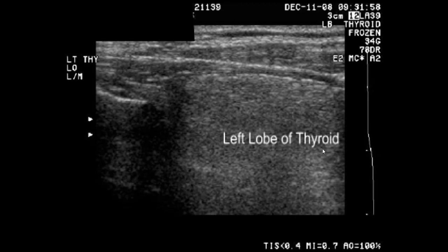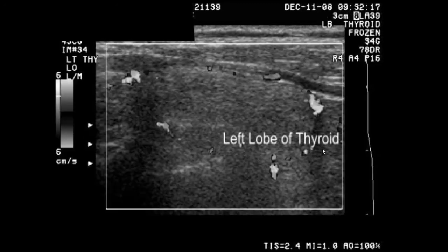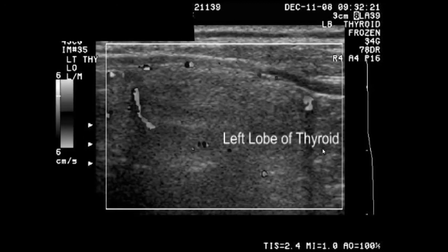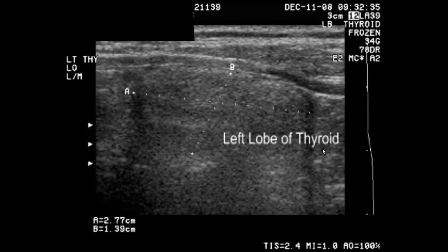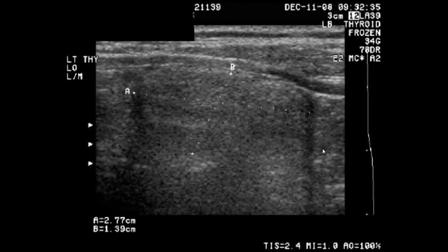Here again, we can orient ourselves by finding the left lobe of the thyroid in relationship to the trachea. The trachea is seen on the left side of the screen.